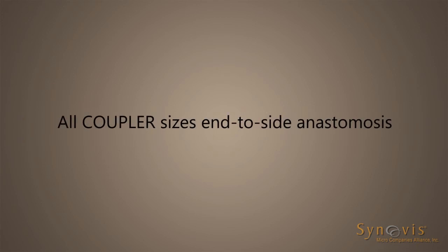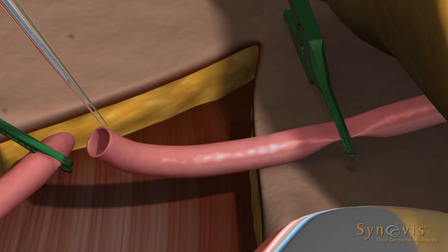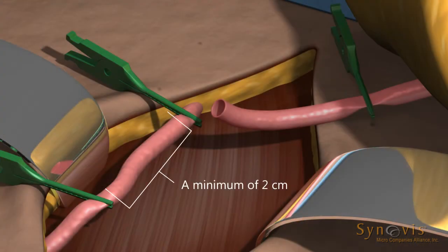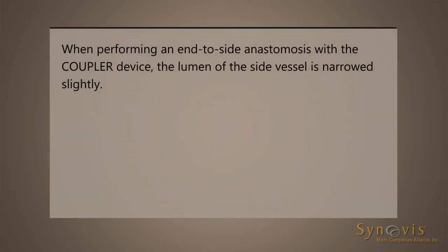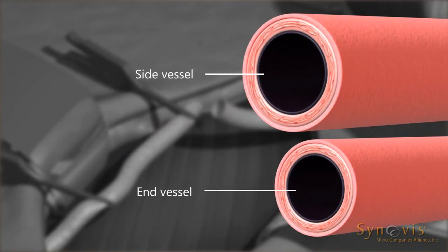All coupler sizes end-to-side anastomosis. Using conventional microsurgical technique, mobilize a minimum of 1 cm of the vessel end. Using vascular clamps, clamp off the vessel and irrigate the vessel opening. Mobilize a minimum of 2 cm of the side vessel and clamp off the vessel. When performing an end-to-side anastomosis with a coupler device, the lumen of the side vessel is narrowed slightly. For this reason, the diameter of the side vessel should be larger than that of the end vessel when completing such a procedure.